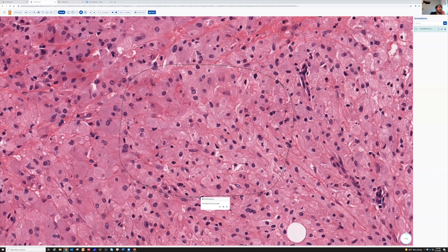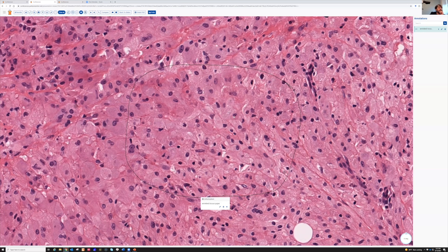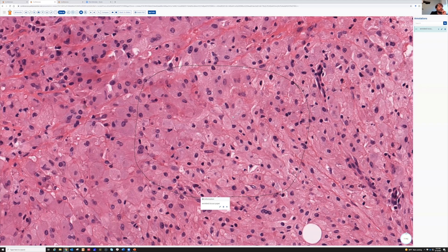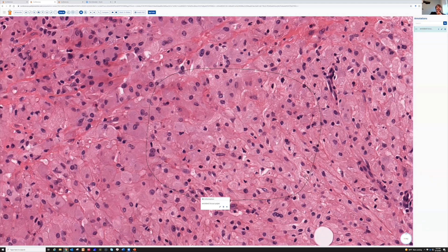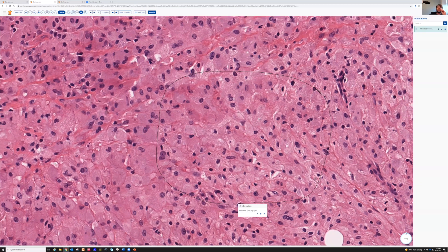Very good — Patricia Barrios and Mireille Bolvin both get points for recognizing a storage disease. This is Gaucher's disease, which is something I rarely encounter. This is the wrinkled tissue paper — this kind of stringy, fibrillary look to the abundant pink, fluffy cytoplasm.